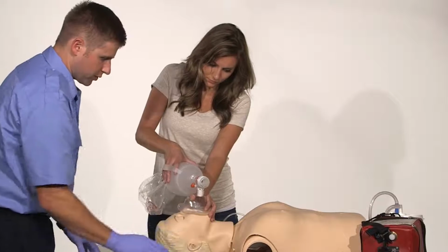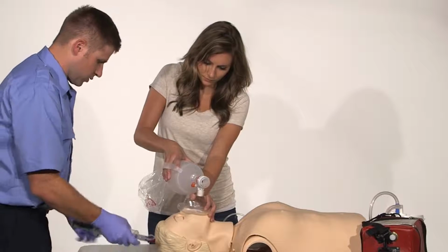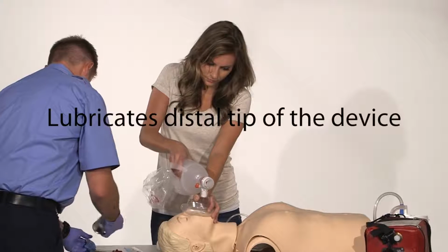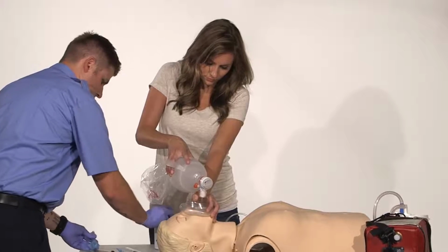Connected. Got all the right equipment. Securing device. All right. I'm going to lube the distal tip. Alright, put lube on the distal tip.